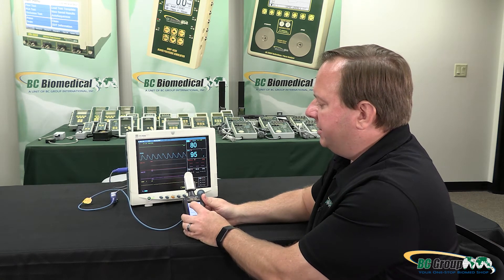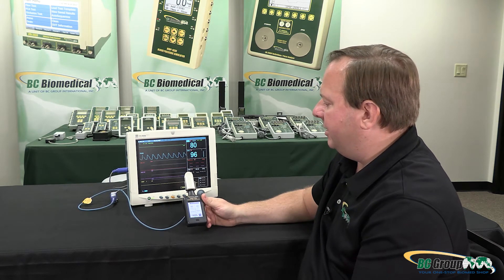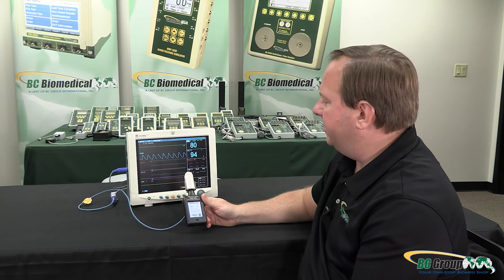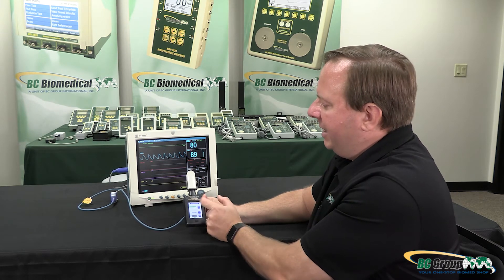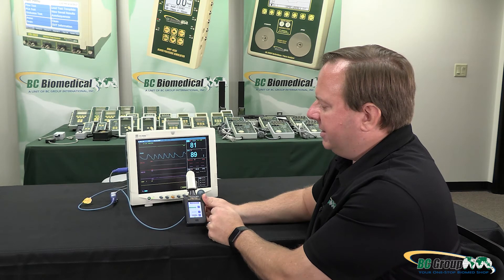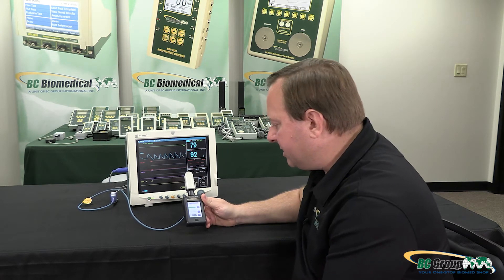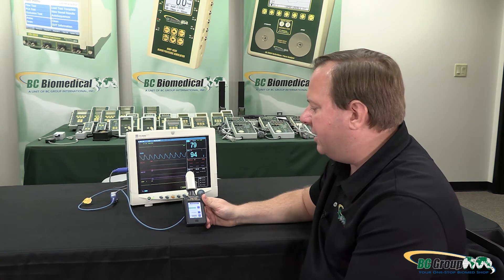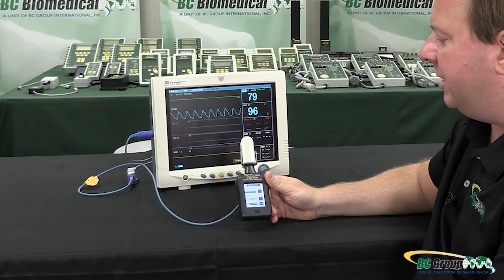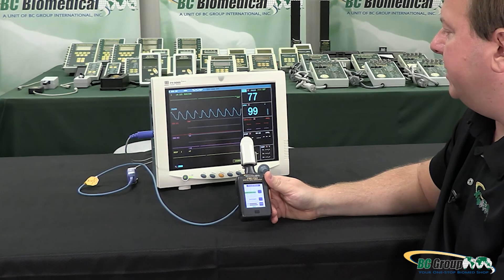If I change through SpO2 selections, I went through and selected 90% — give it a little bit of time and it should stabilize on our new reading. If I go to manual mode I can select manual mode at any time and step through the settings. In this case it is 98% SpO2, 80 beats per minute, and hypoperfusion, and it should stabilize within a few seconds.